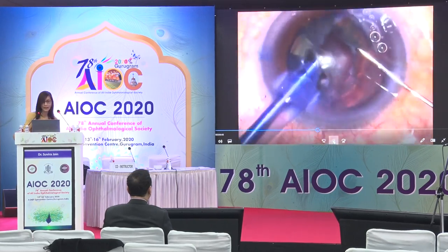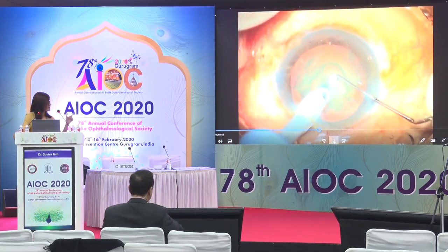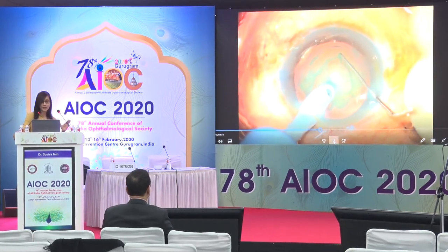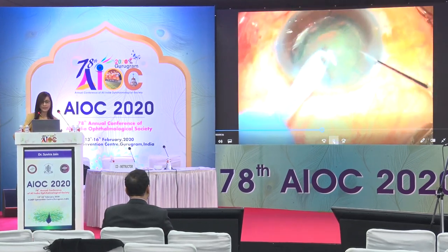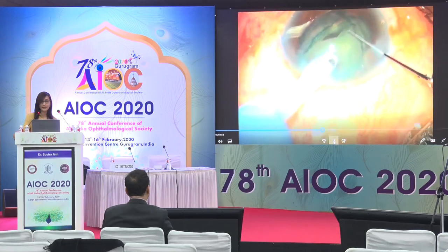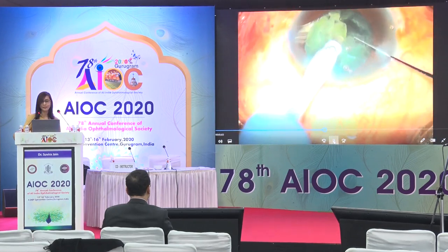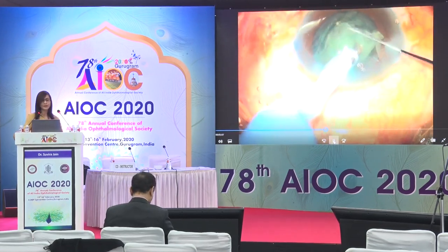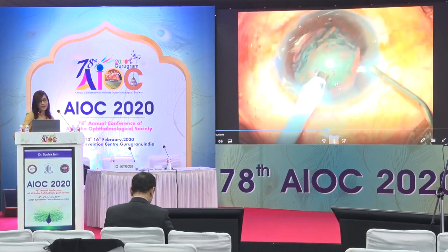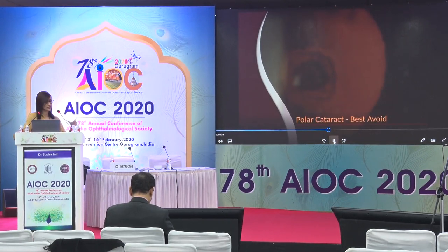As cataracts get harder, hydro delineation may be a little challenging. Having achieved the best hydro delineation possible, you do a direct chop with limited lateral separation. The surgeon attempted lifting up a fragment — it didn't come up — so gone to the other side, done a tiny chop, removed a fragment, after which the subsequent emulsification is like any other case. The main thing is to keep your settings controlled and gentle.